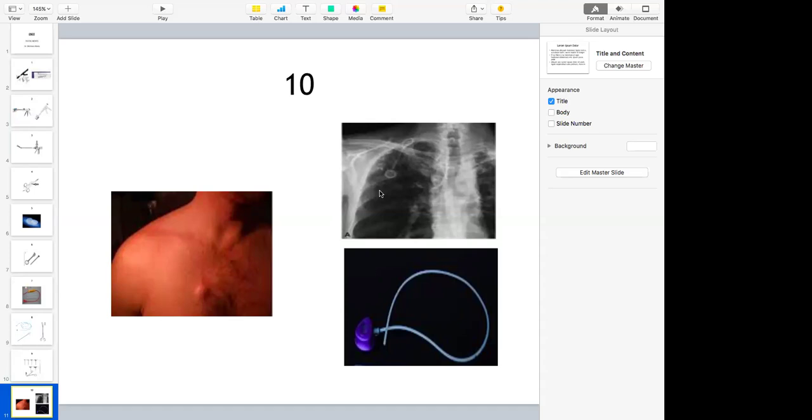What kind of needle is used for injecting drugs through the chemoport or for aspirating blood through the chemoport? There's a specialized needle so that the silicone covering of the chamber is not damaged by the needle. Do you know the name of the needle? It's a Huber needle.